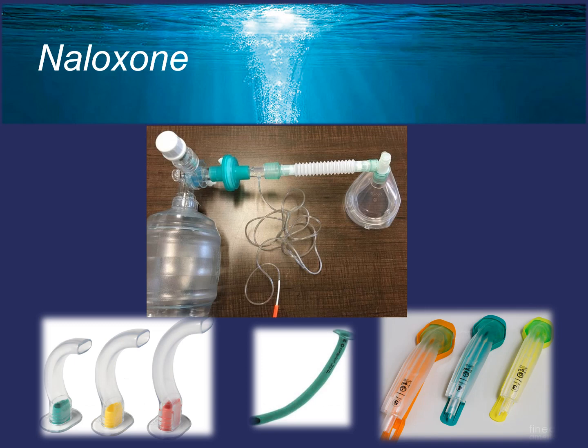Prior to administering naloxone, ensure airway management with the use of an OPA, NPA, BVM, oxygen. Hook up the capnography sensor to the Zoll. Get your reading and titrate respirations to facilitate an end tidal to normal ranges and increase oxygenation. Do not administer Narcan until you correct the hypoxia and the hypercapnia.